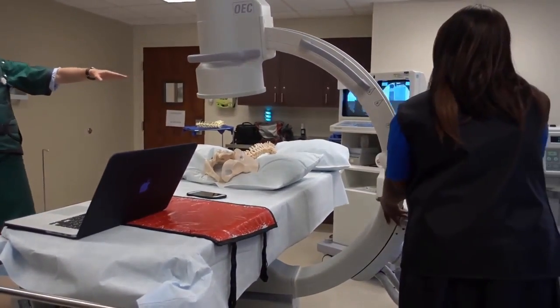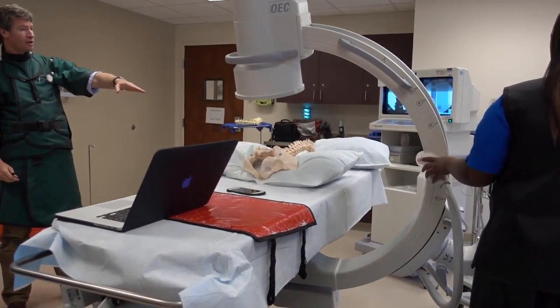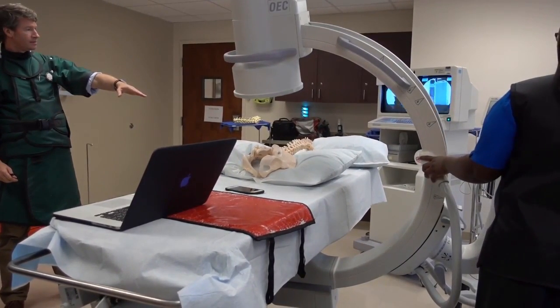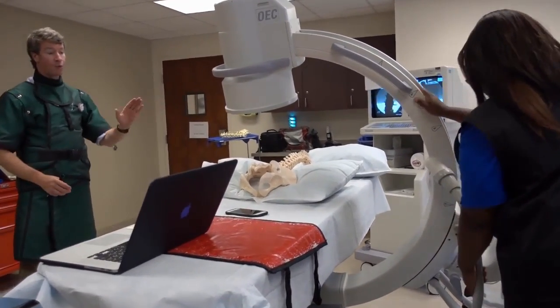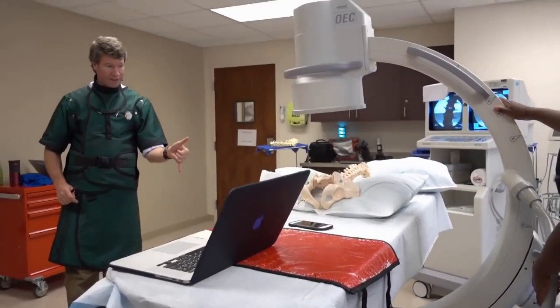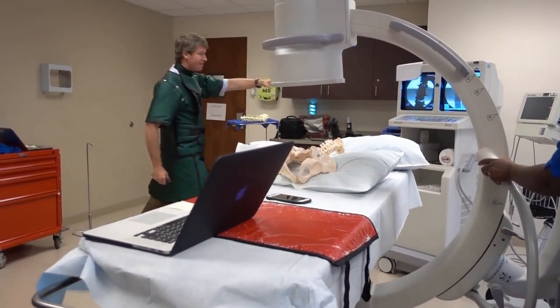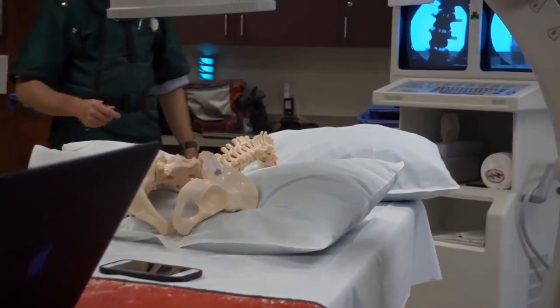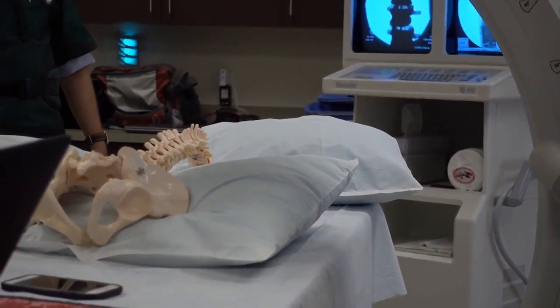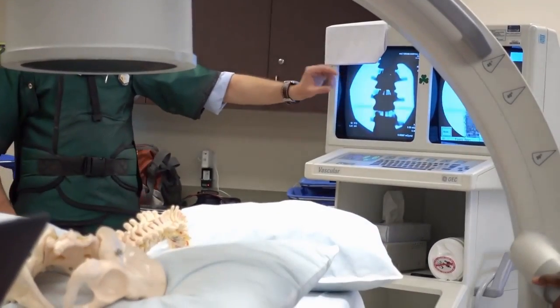So you see what Michelle's doing here. She's moving the C-arm. First she's going to go up and check to see if this makes it more clear. It doesn't. So now she notices that it doesn't, so she's going to try more caudocephalad angulation. It's better, right? Now you can see space between the discs right here. And maybe even a little better. Let's try it a little more caudocephalad. That's even better. See, now this disc is even wider and thicker.